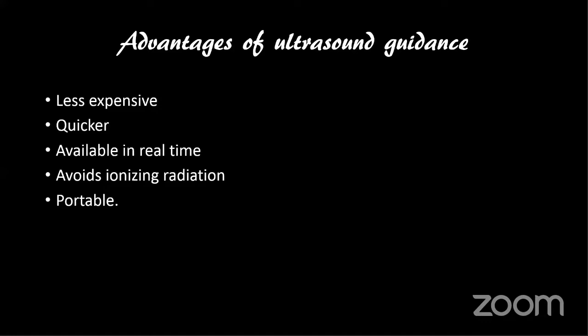And one of the very important advantages of ultrasound as a guidance modality for any intervention is that it is real time. It shows us the needle. It exactly shows where we are going into the lesion. It is a modality by which we can actually decide our trajectory to target the lesion where we are going to intervene. Then it is portable. We can often perform bedside interventions also, and it of course avoids ionizing radiation. So whenever we have a lesion, we often try to visualize it on ultrasound because it offers the ease of performing any intervention within the breast.